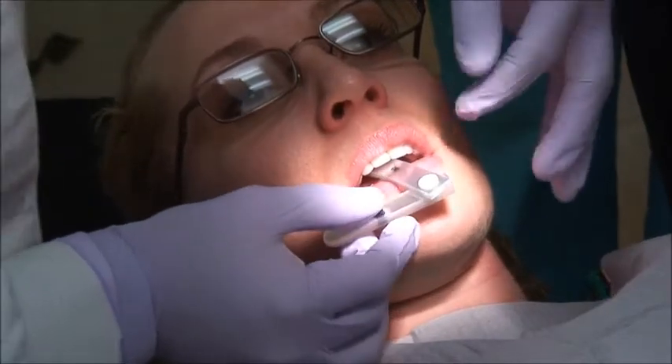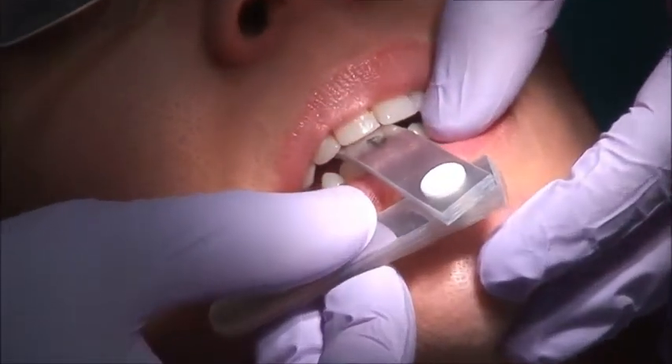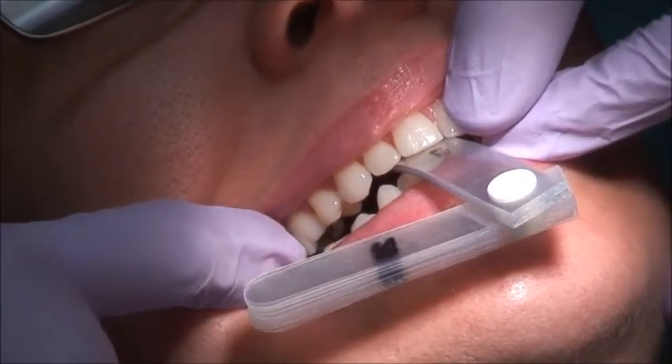Okay good, that's it. Now when you squeeze in the back, go back and squeeze. Are you touching in the back at all? No. You don't feel any contact in the back?